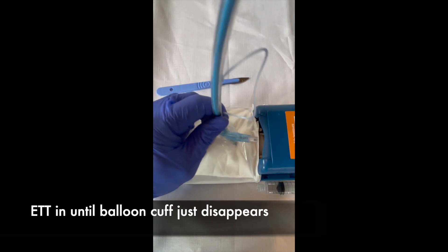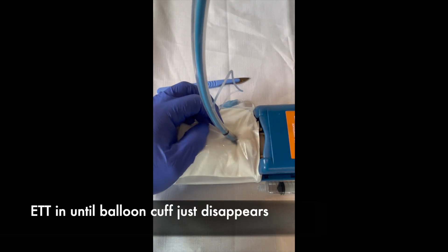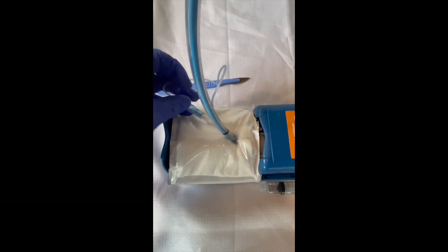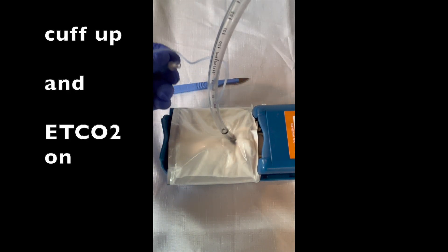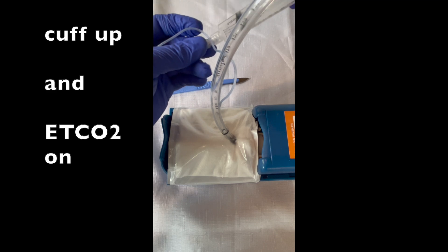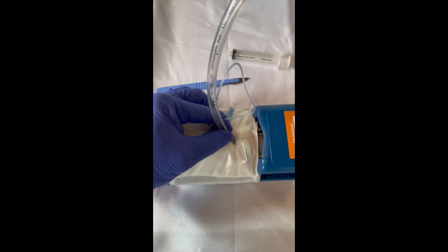That goes in nice and easy. The balloon disappears. We can then take the bougie out. Inflate the cuff. And we're ready to ventilate.